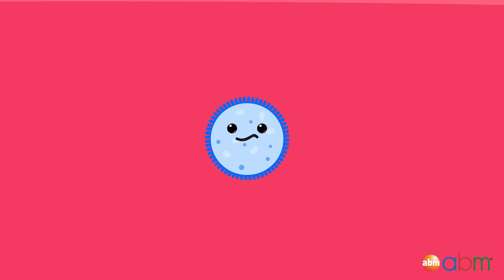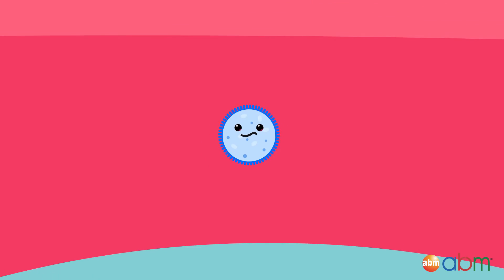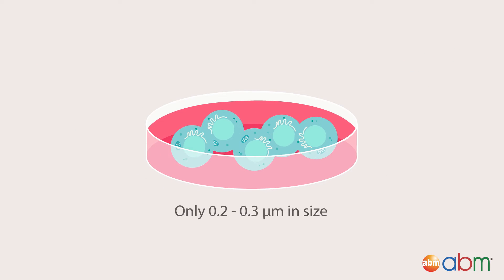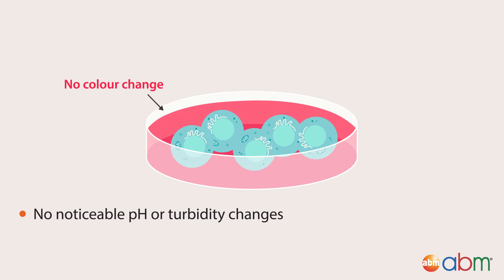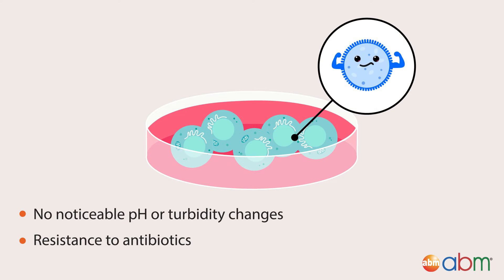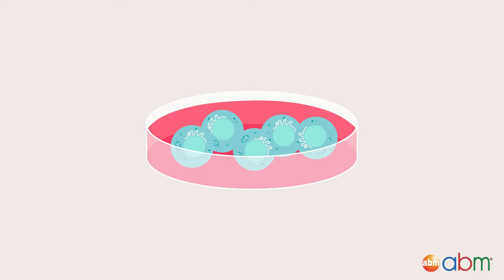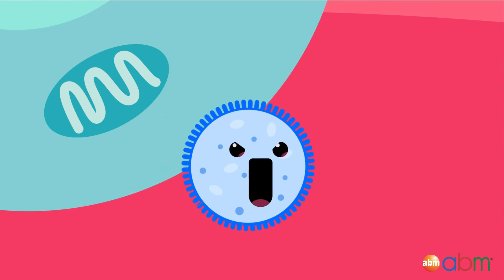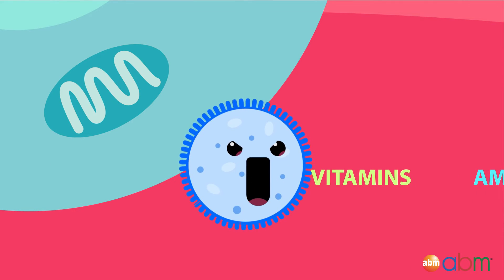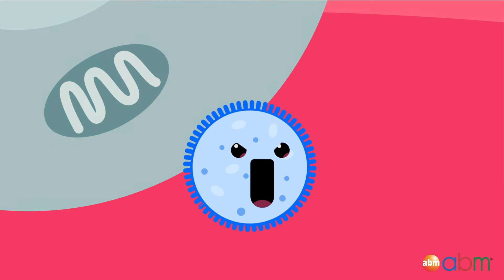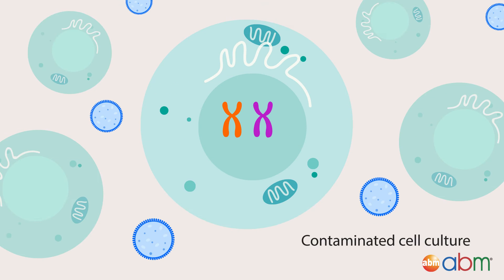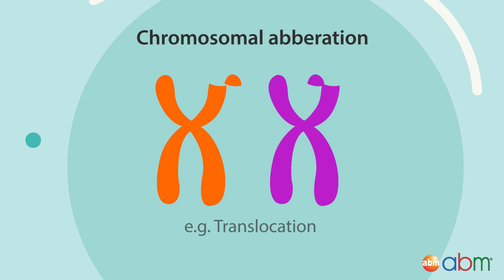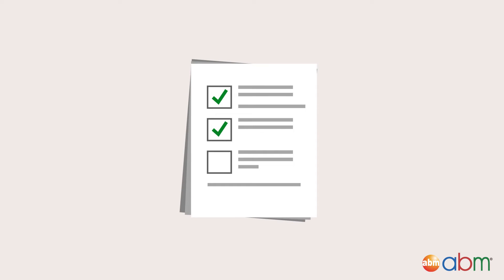One of the most common unnoticeable types of contamination is mycoplasma. Mycoplasmas are a type of bacteria that are only 0.2 to 0.3 micrometers in size, which makes them hard to see. They do not cause noticeable pH or turbidity changes, and they lack a peptidoglycan cell wall, which makes antibiotics ineffective against them. Once mycoplasma infects your cell culture, it can cause cells to die as they take up most of the available nutrients. What's most scary is that mycoplasma can also cause chromosomal aberrations and change gene expression profiles without actually killing your cells, therefore affecting your experimental results without your knowledge.